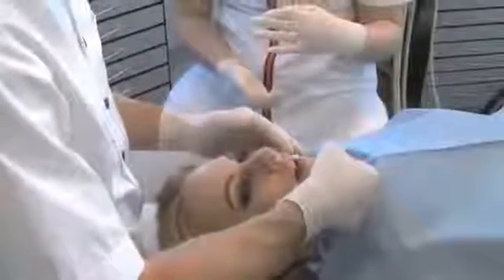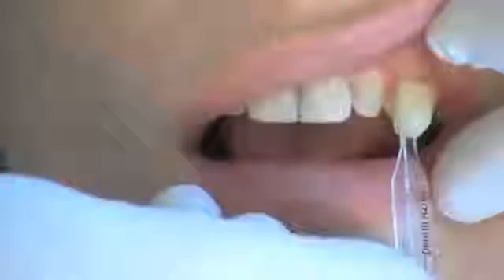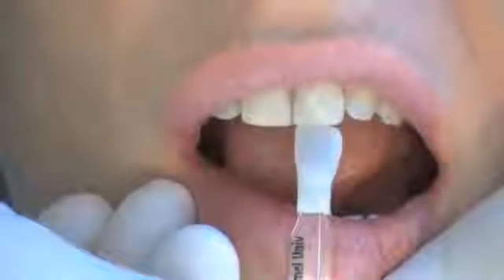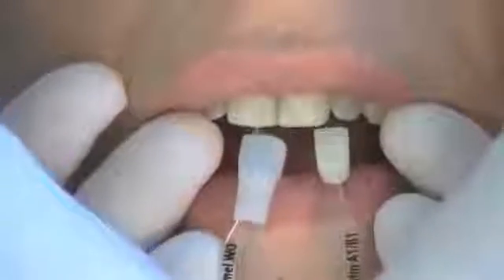Before the preparation, the dentine and enamel shade are determined cervically and incisally, respectively, on the teeth using the shade guide. The interplay between dentine and enamel can be determined by placing the shade guides on top of each other.